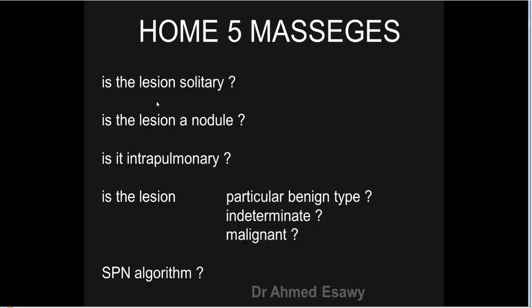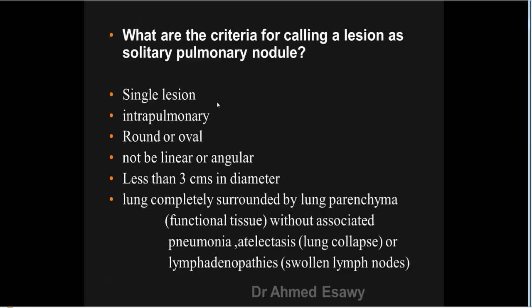First, is the lesion solitary? Is the lesion a nodule? Is it intrapulmonary? Is the lesion benign, indeterminate, or malignant? Solitary pulmonary nodule algorithm: what are the criteria for calling a lesion a solitary pulmonary nodule?